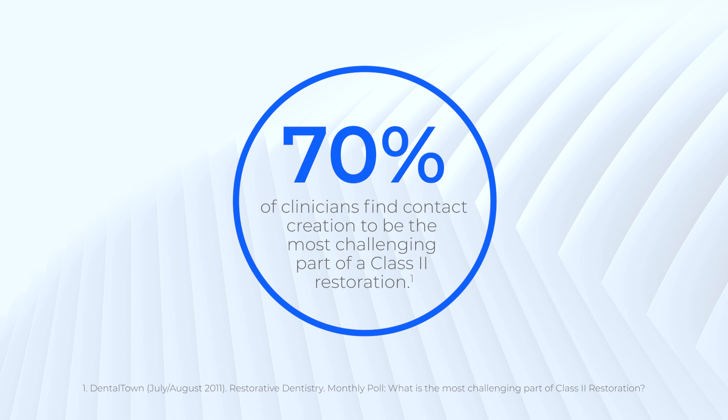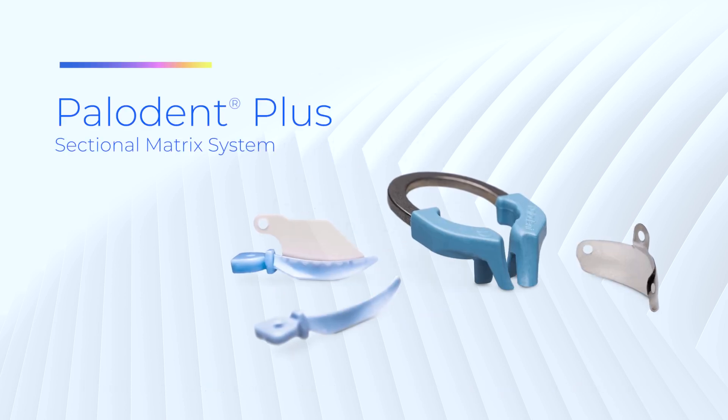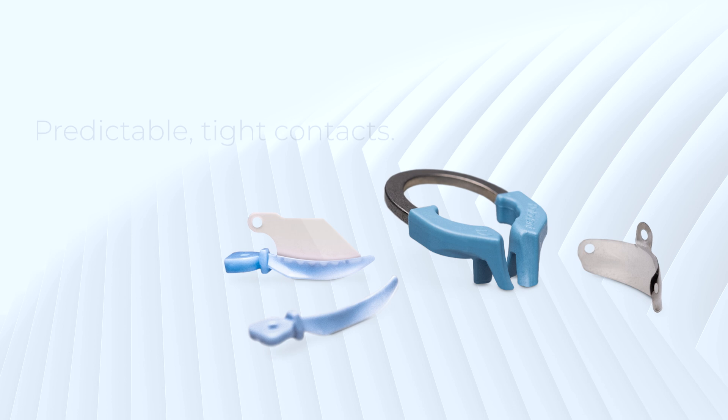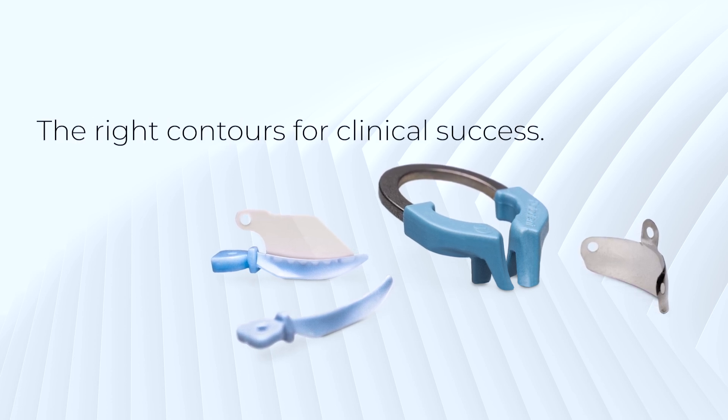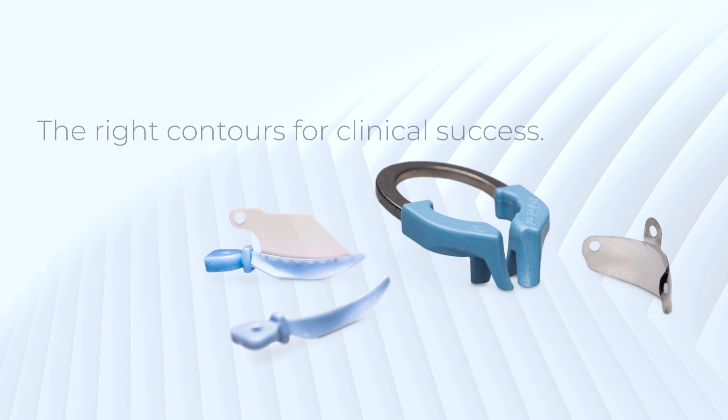Did you know 70% of clinicians find contact creation to be the most challenging part of a class 2 restoration? The Palodent Plus system is an innovative sectional matrix system that delivers predictable tight contacts and restorations that accurately replicate the natural tooth anatomy.